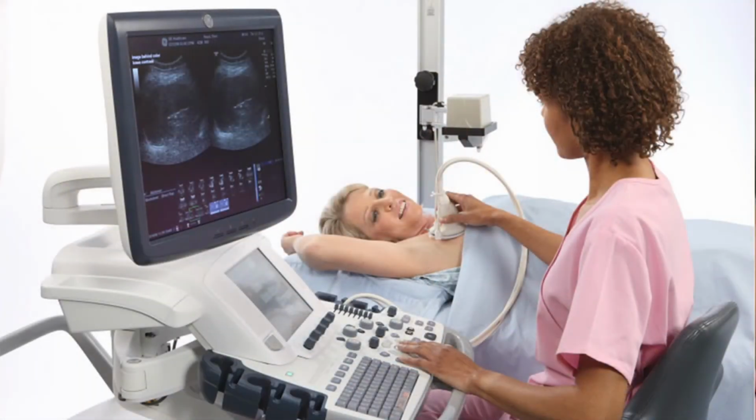Up until now, breast ultrasound actually decreased specificity with increase in unnecessary biopsies. Standard ultrasound is almost like a painting. It's operator dependent. How do you paint the picture? By moving the transducer all over the breast. Did you get all of the breast? You're not quite sure sometimes. And the woman is lying on her back and sometimes the breast moves.